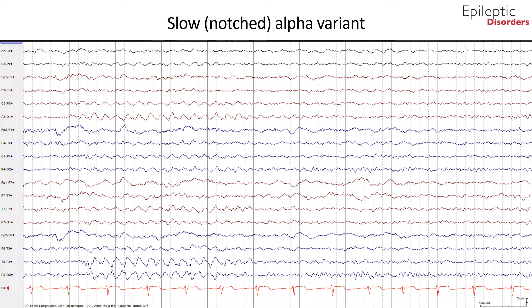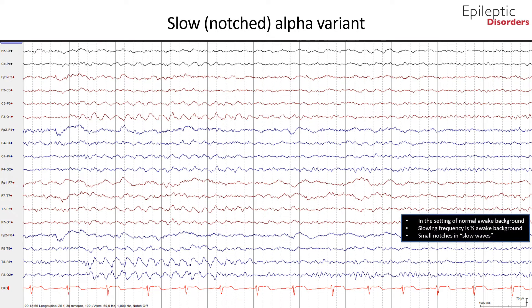Slow alpha variant is challenging to detect and may easily be misinterpreted as occipital slowing. This tendency to misread slow alpha variant as abnormal stems mostly from the fact that slowing is such an easily recognized abnormality. As a generally helpful rule, any time one sees occipital slowing, one must always think of slow alpha variant first before calling the record abnormal. One should always look for a sample of normal awake background within the record. If the slowing is appropriately half the frequency of the patient's awake background, then the slowing is probably just a slow alpha variant. An additional clue can be a small notch or notches in some of the slow waves, bearing in mind that the notches can be quite subtle.